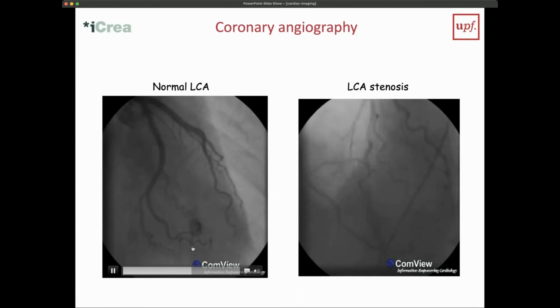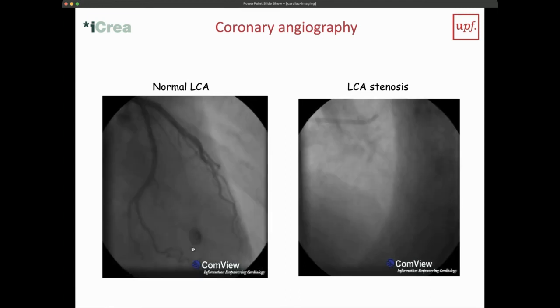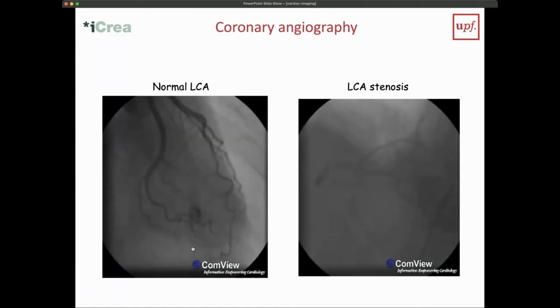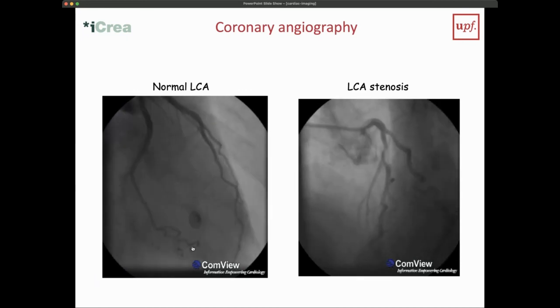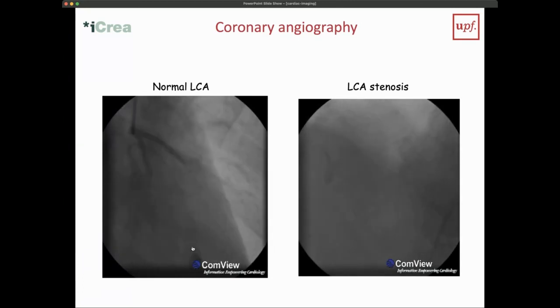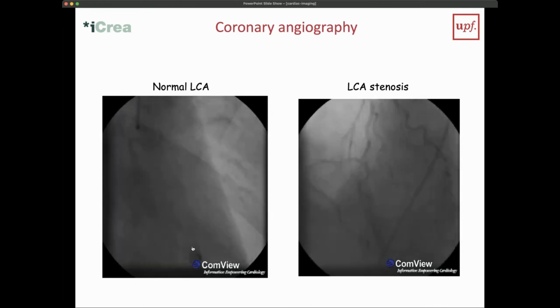And because it's dark, it's absorbing a lot of X-rays. So the material can be, as we said before, either bone, but it's even darker than the ribs. It could be contrast, but contrast like this is also extremely abnormal. So it's likely a metal, because metal also absorbs a lot. And this is actually an ECG electrode, which is on the chest of the patient.